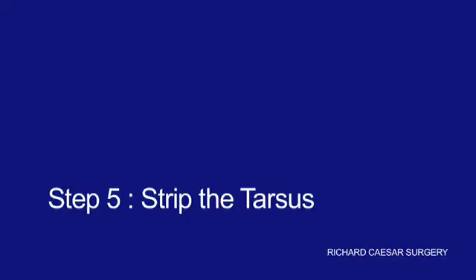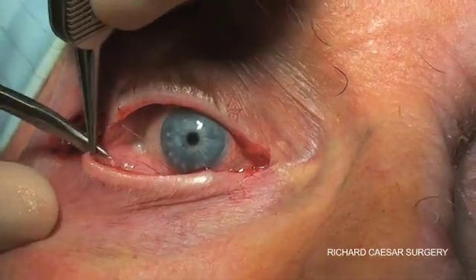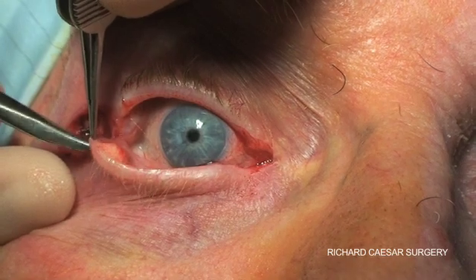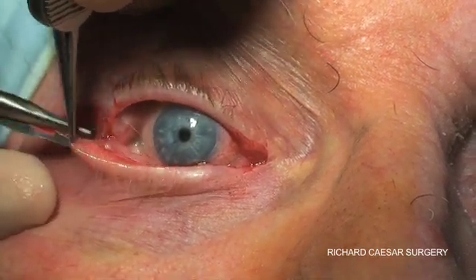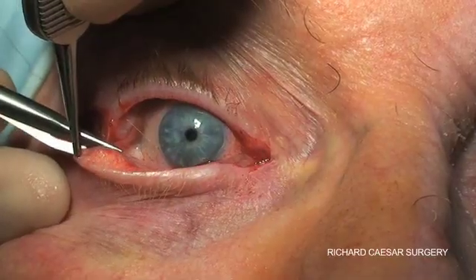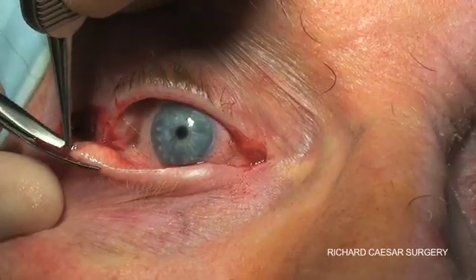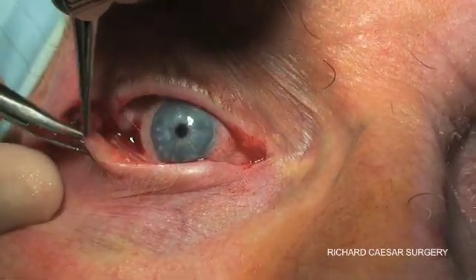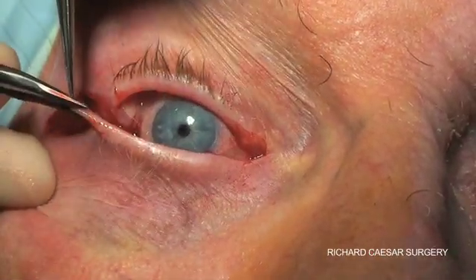The next step is the actual tarsal strip. If you get hold of the lateral edge of the tarsal plate, trim gently off at the bottom. Make a pocket between the plate and the orbicularis and then a couple of little snips at the inferior edge of the tarsal plate, then putting one arm of the scissors in the pocket, a couple of snips.